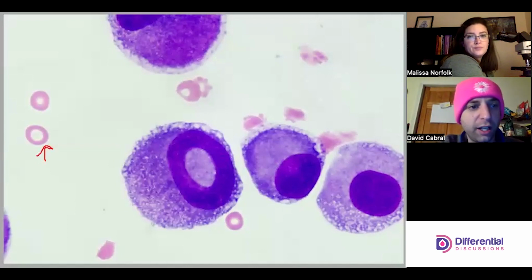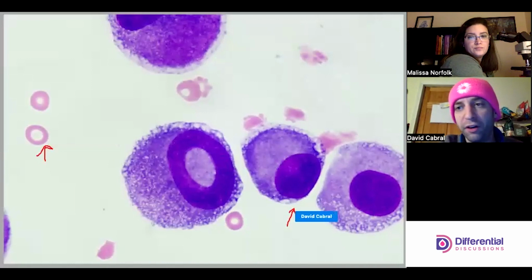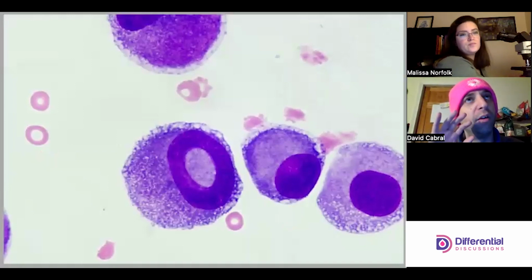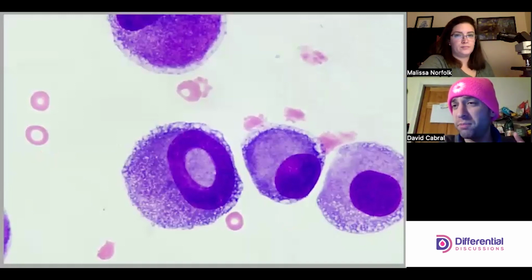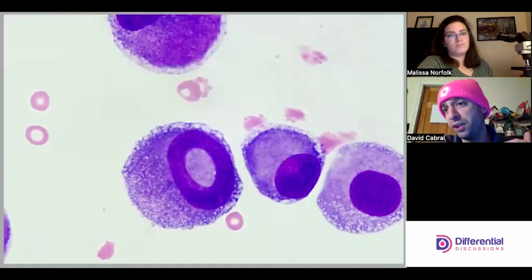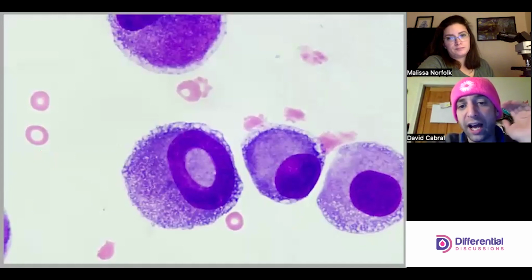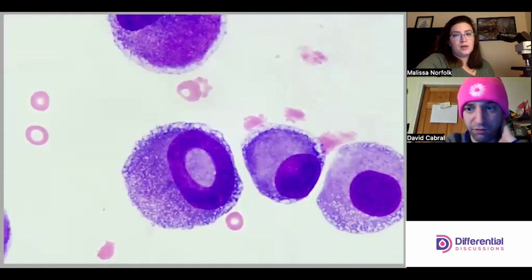This is a single cell down here, and there is no reason physiologically why that nucleus should stain like that, but for the fact that there's something going on, that there could be a malignancy. So take the variation in staining. Sometimes it's so bad you can't even tell where the nucleus ends and the cytoplasm begins. So I am very troubled by these cells, and this is going straight to path, in my opinion.